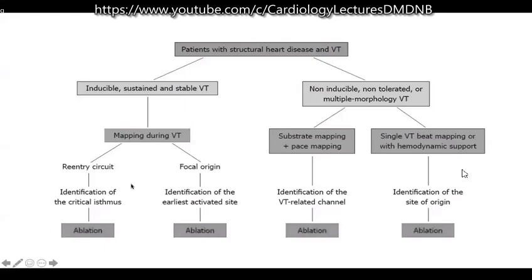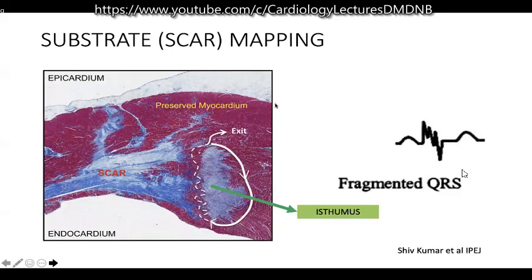So what do we do to prove the reentry of the tachycardia? We do a maneuver called entrainment, which most of you must have heard. So first is the substrate mapping. The substrate mapping is done during the sinus rhythm. So what is the premise of the substrate mapping?